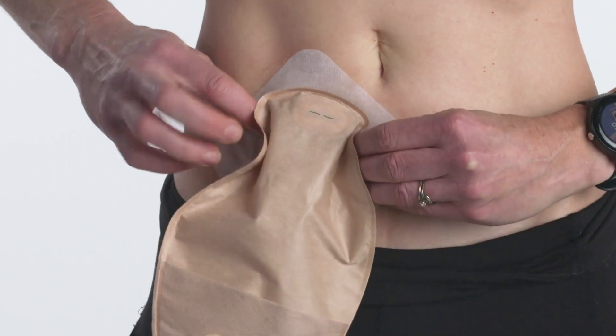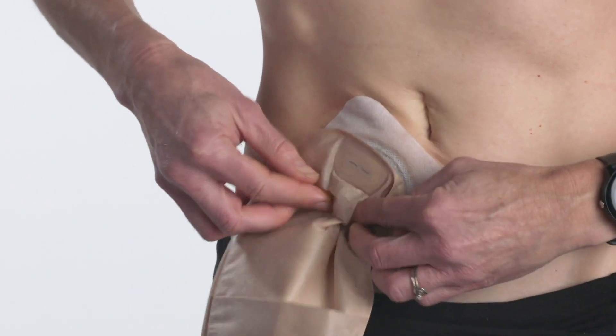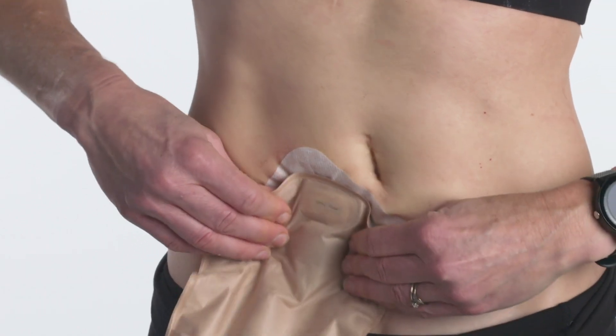Press the two flanges together beginning at the bottom, working your way up to the top. Double-check that the flanges are snapped securely together by pressing all the way around them a second time.